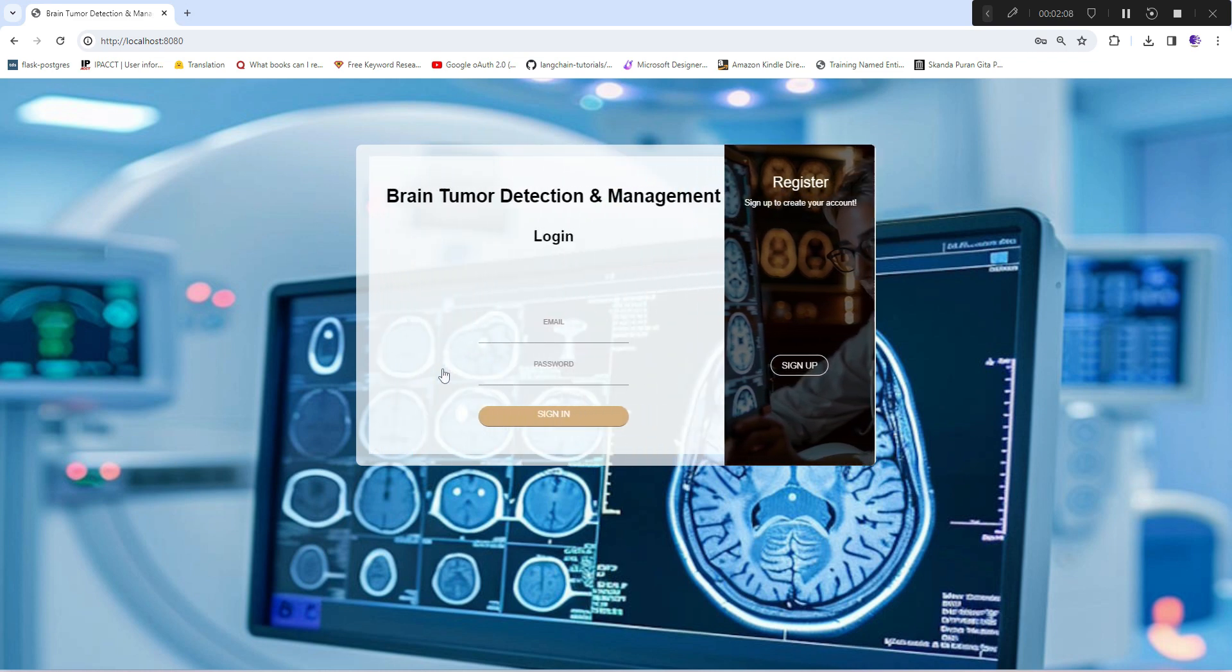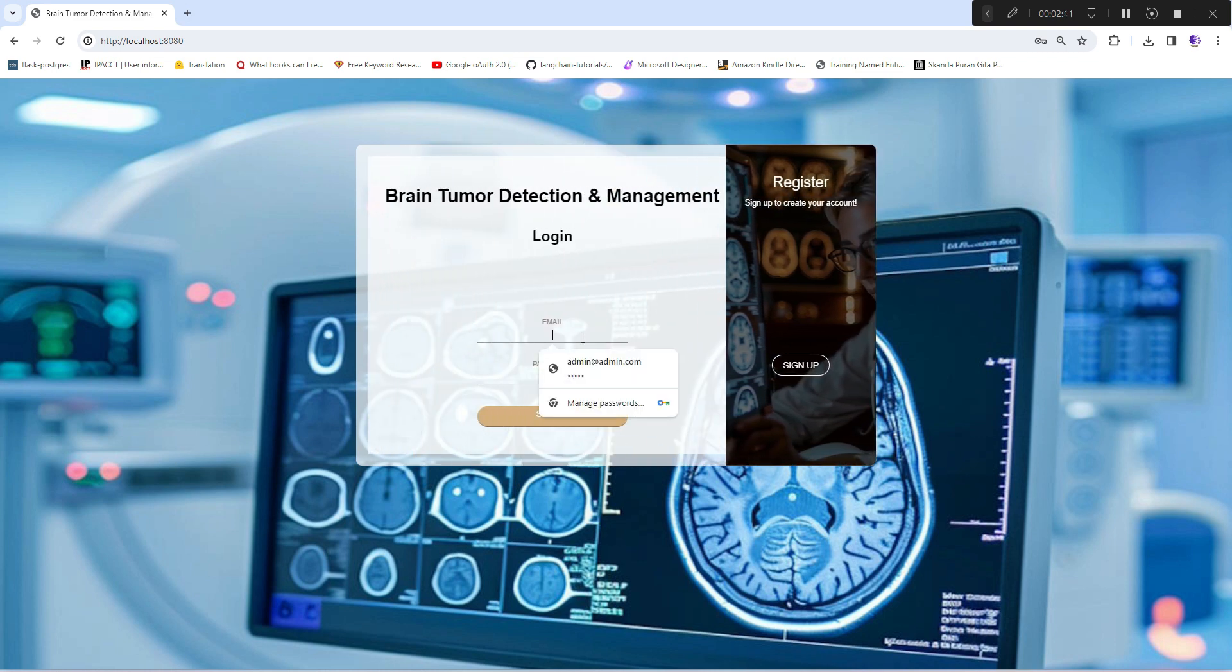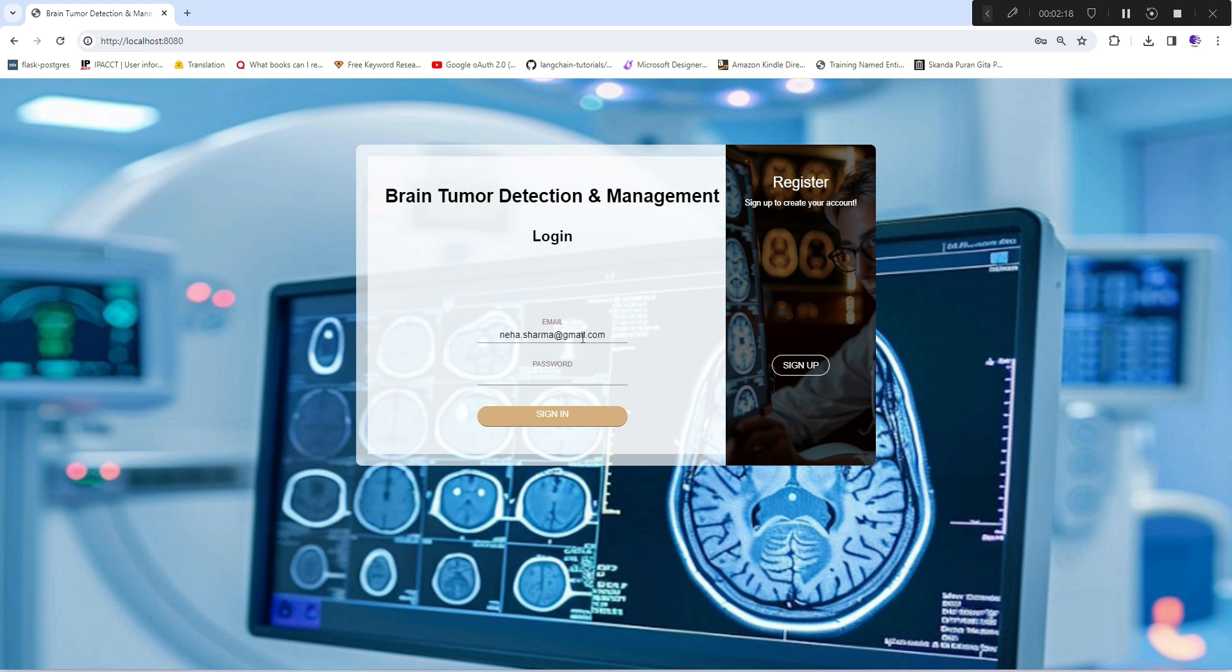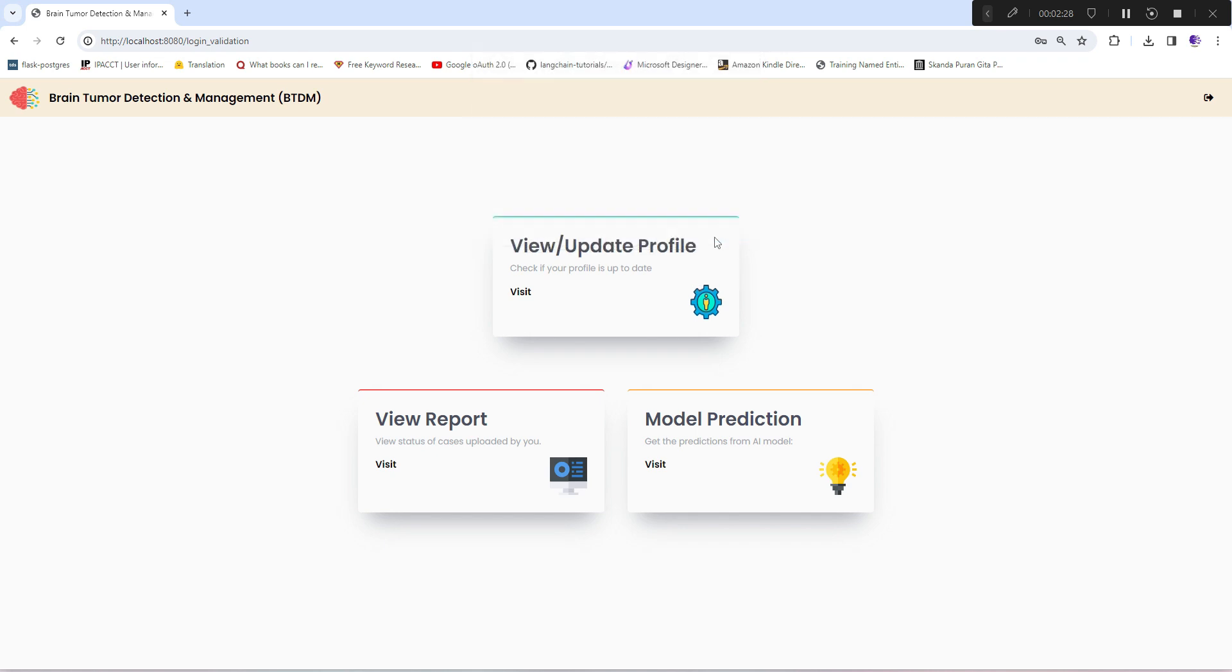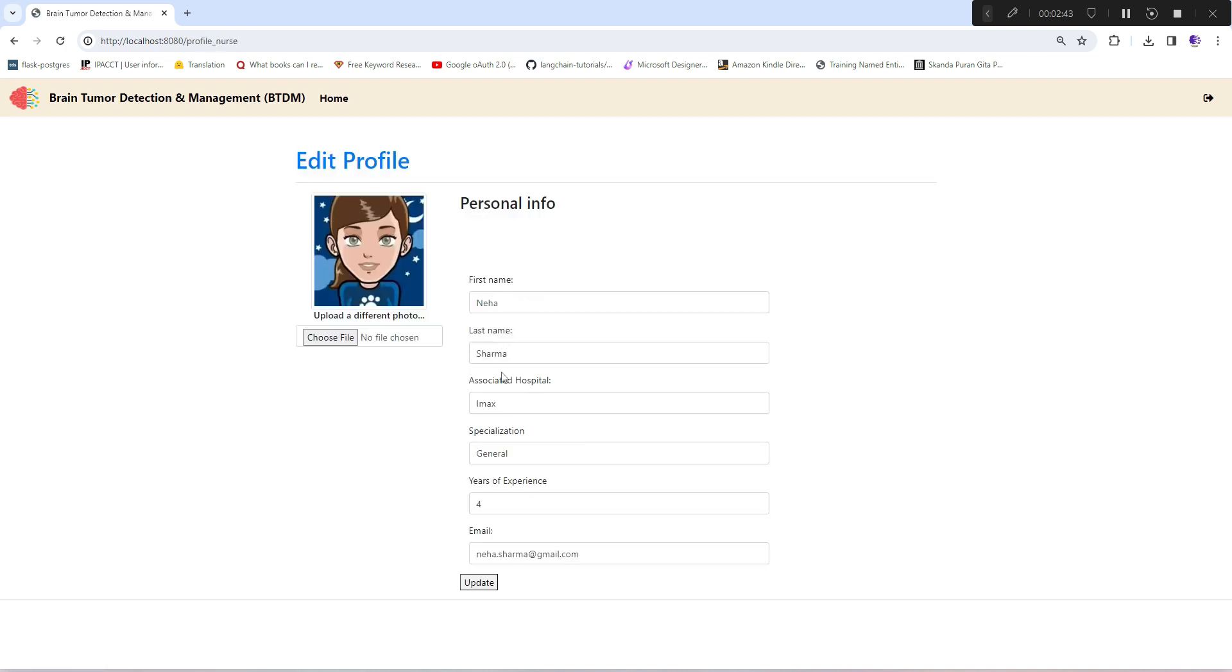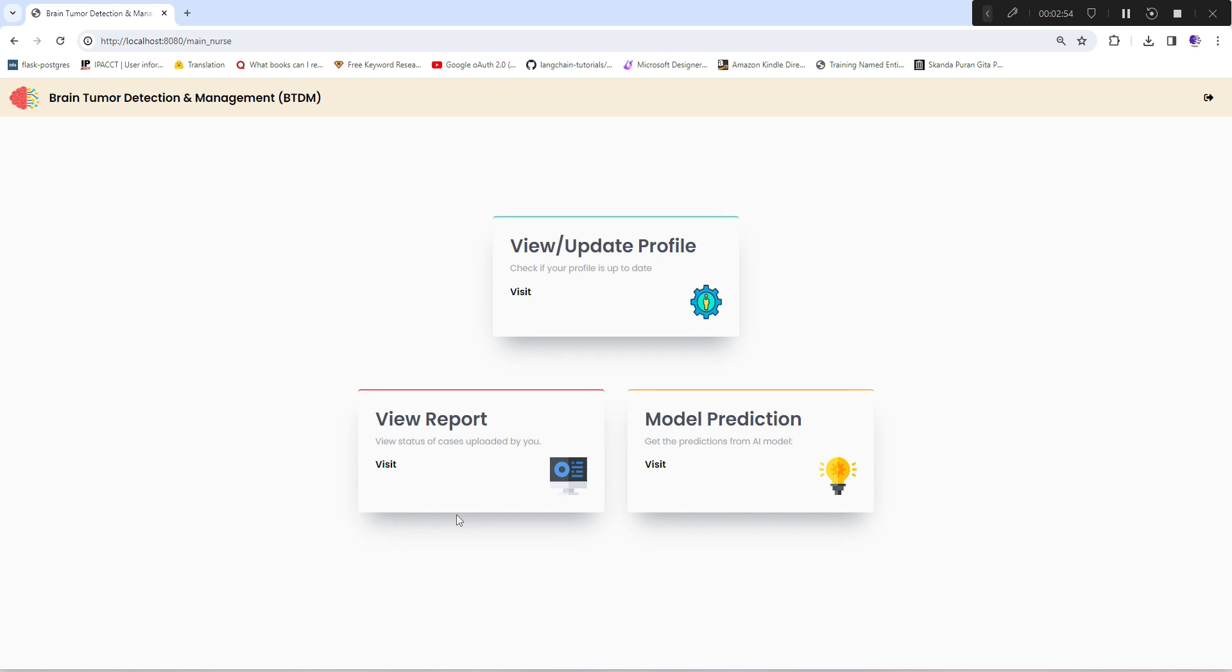Now if you see, this is the home section or mini dashboard where all three options are available to the nurse. In this option, she can update her details - specialization, associated hospital, years of experience - and she can also upload her image and update it.